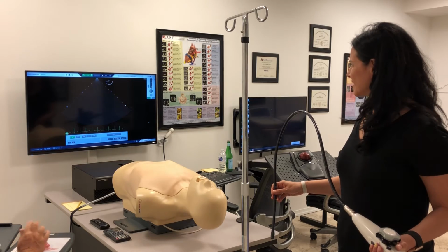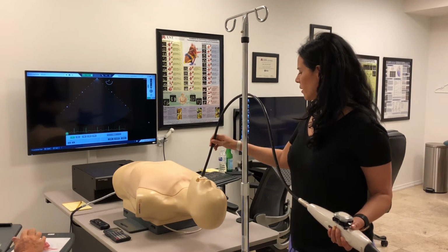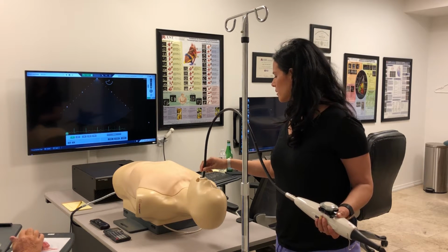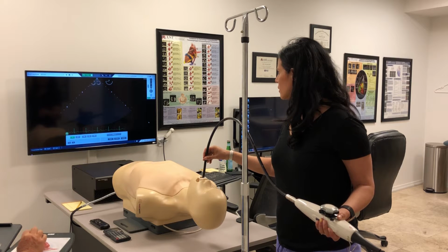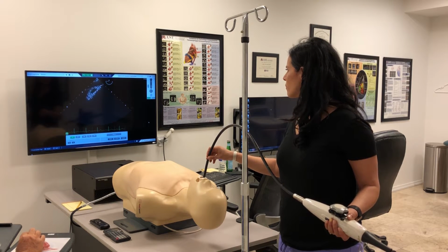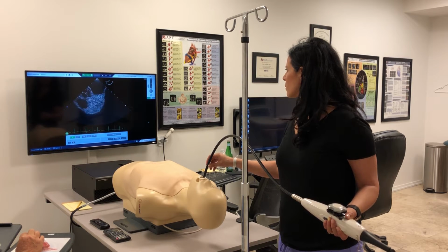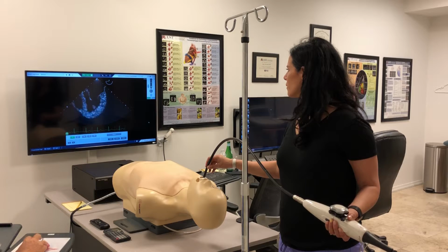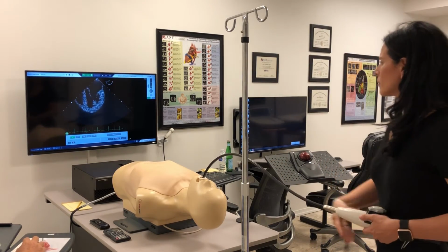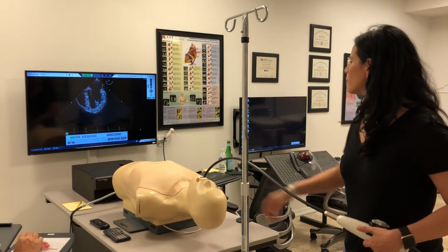Okay, first view will be mid-esophageal four-chamber view, so let's go ahead and insert the probe. Here's the great vessels, and that'll be usually the first image. We'll look for the left atrium. And I'll deepen the field for you a little bit. So let's go ahead and maximize the left atria.